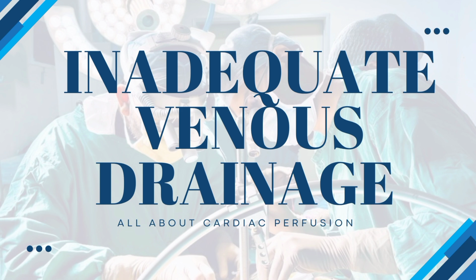Why is venous drainage important? Veins carry blood back to the heart. It is deoxygenated blood. In the CPB, we are draining deoxygenated blood, and we give oxygen to the blood and return it to the patient. It will regulate normal tissue oxygenation during the surgeries and prevent swelling, pressure buildup, and edema. So these are things prevented in the CPB.